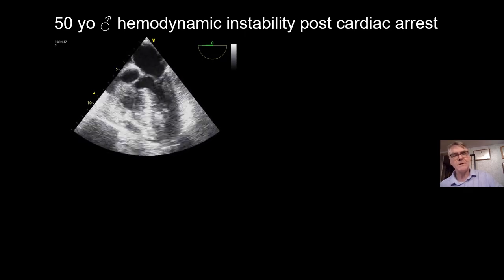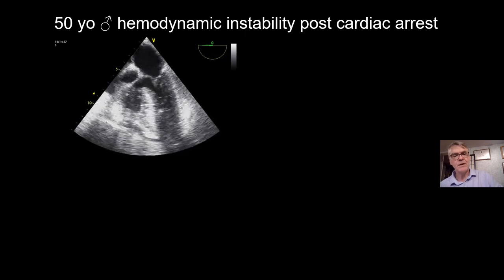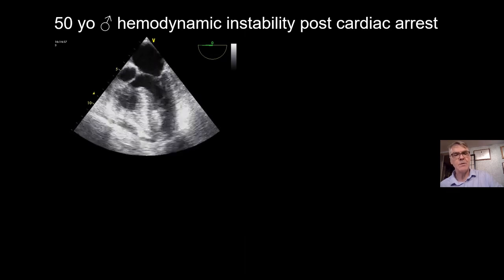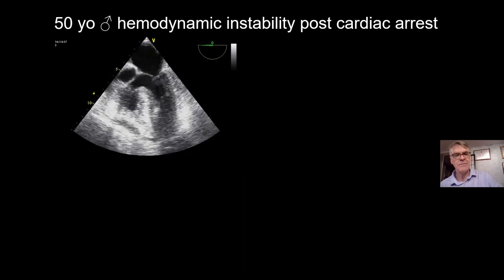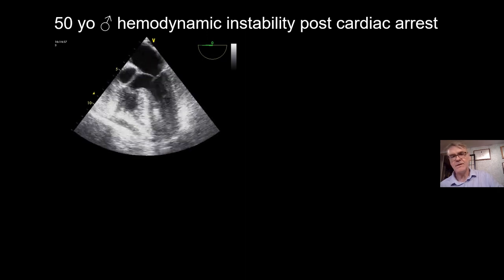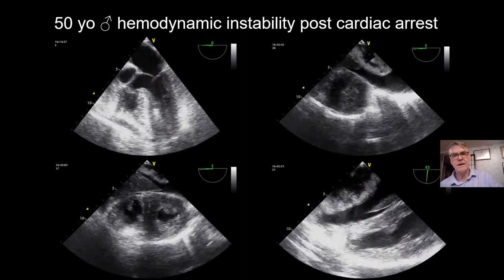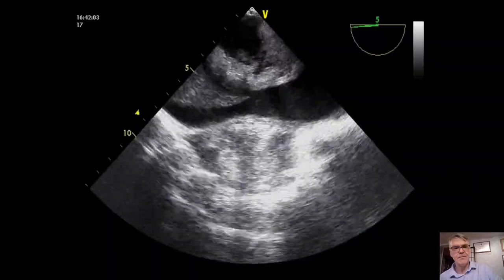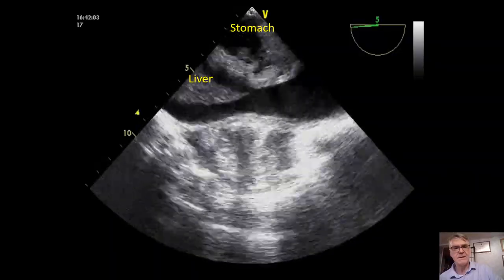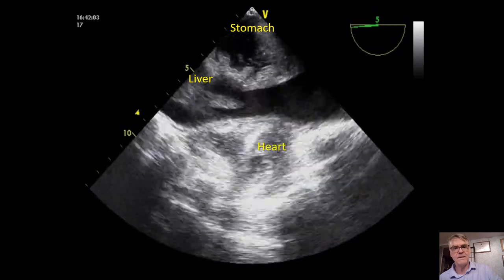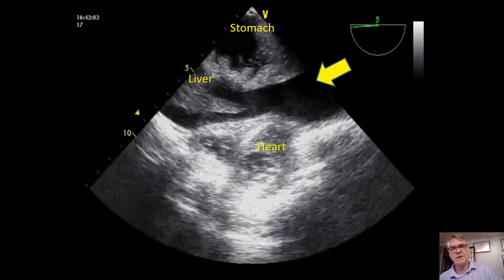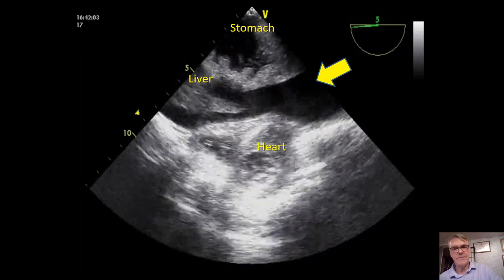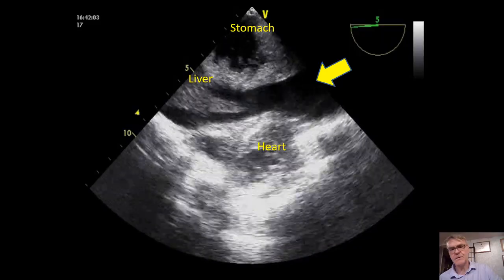Here is an example of a 50-year-old man who was unstable after cardiac arrest. Once resuscitated, you can notice a very empty left ventricle with near outflow tract obstruction. Since the cause of hemodynamic instability is definitively not the heart, it's important to move to the abdomen — and when you do, you can see free fluid. Looking in more detail, this is the stomach, the left lobe of the liver, the heart, and the free fluid. This patient is basically bleeding into the abdomen — free peritoneal fluid.